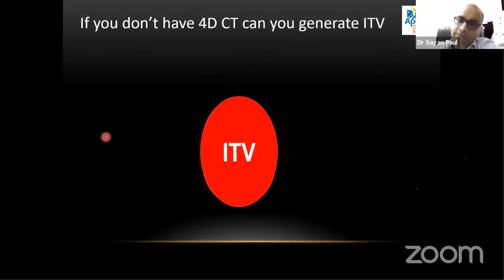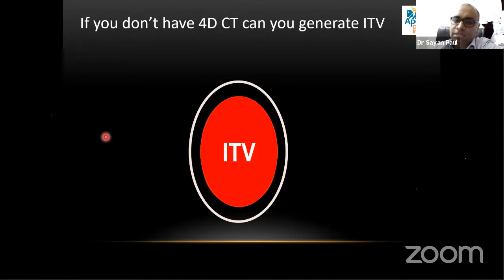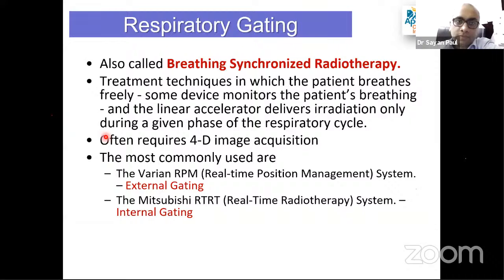One disadvantage is that this ITV is a little bigger than a 4D CT scan ITV, because in a normal breathing pattern we usually do not take deep inspiration or deep expiration. The movement may not be as much, so the ITV can be a little more. But you can generate the ITV, generate the PTV, and do SBRT. I have discussed this with Dr. Suresh Senan, who is the father figure of lung SBRT, and he said, yes, obviously you can do it by generating the ITV in this method.